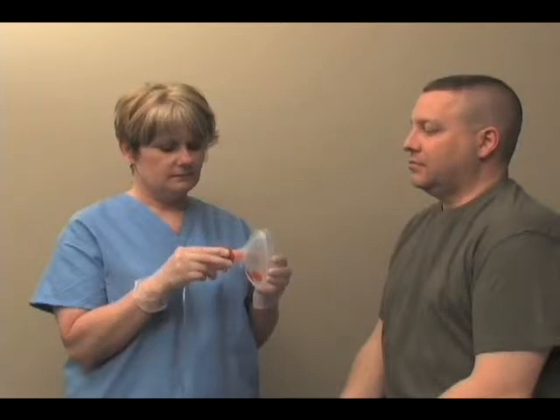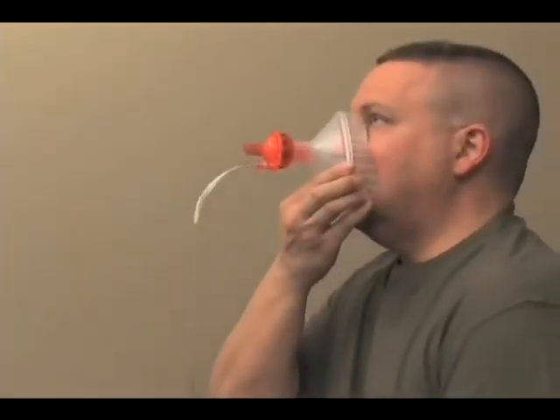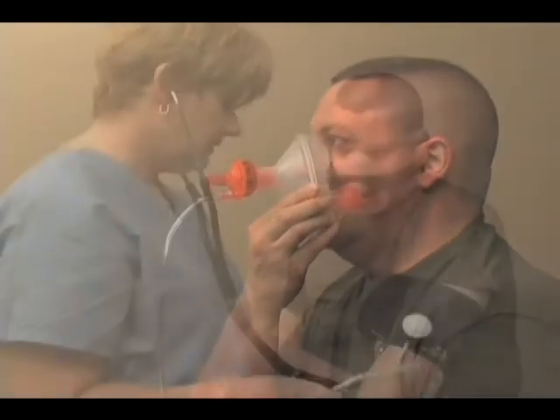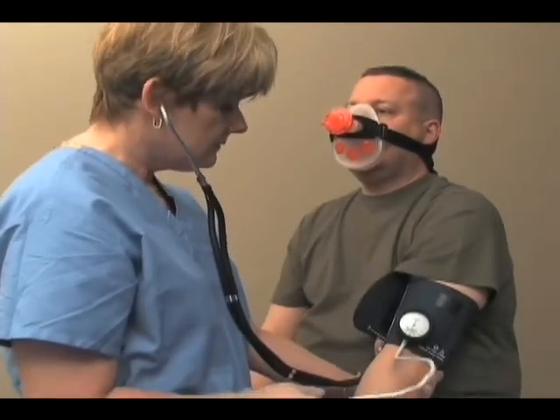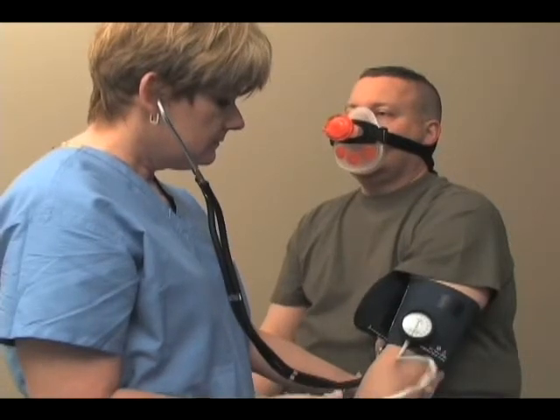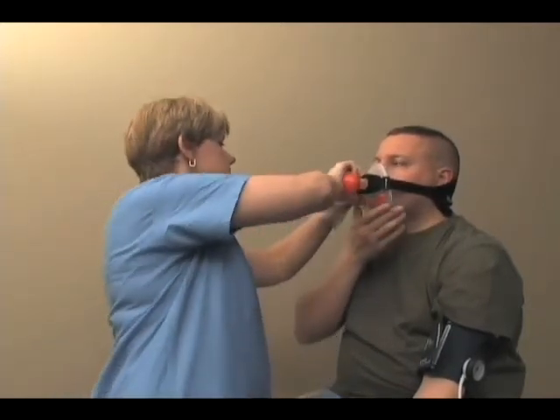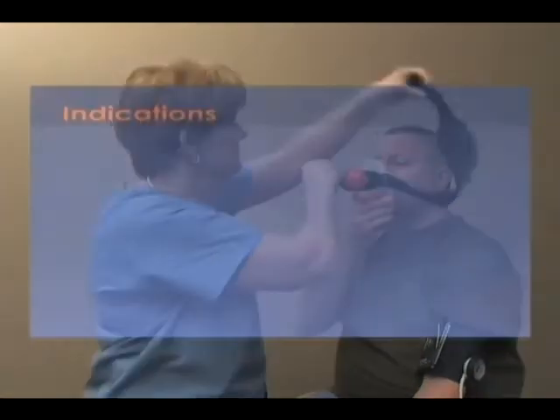If supplemental oxygen is desired, connect the oxygen tubing to the oxygen port and deliver 2 to 15 liters per minute. It is important to continue to monitor the patient's vital signs every 5 minutes while using the ResQguard. Once the patient's blood pressure has returned to an acceptable level, the ResQguard should be removed. If the patient's blood pressure falls again, the ResQguard can be reapplied.